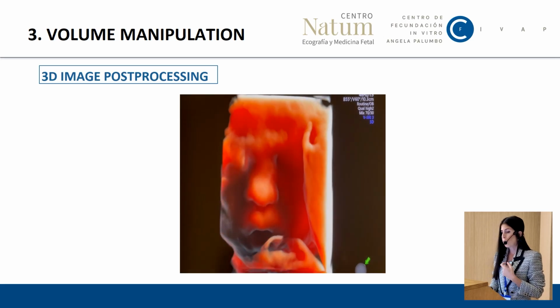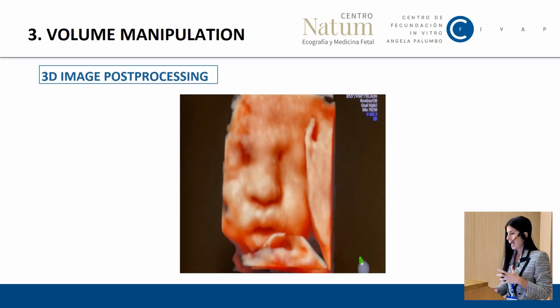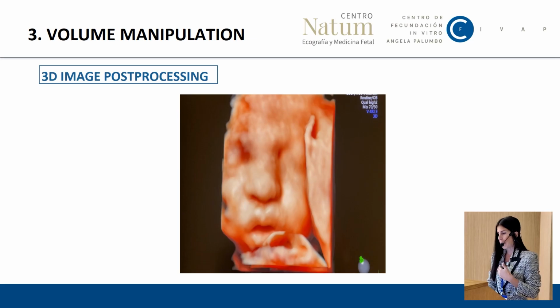We can also do 3D image post-processing. We can modify brightness, contrast, or even the color. We can put shadows, modify different tones of the color.